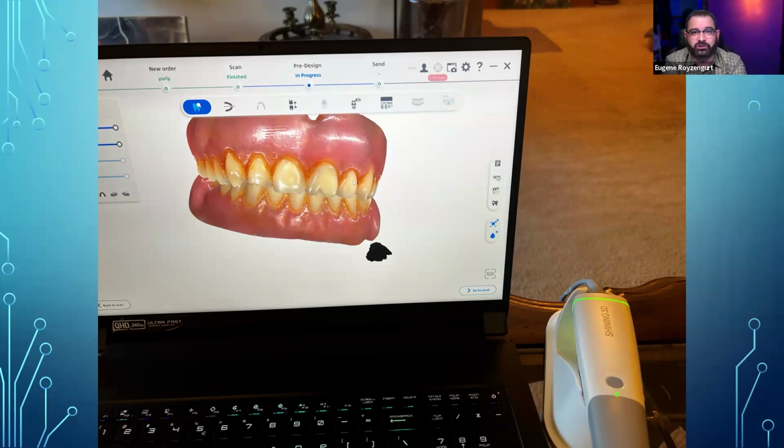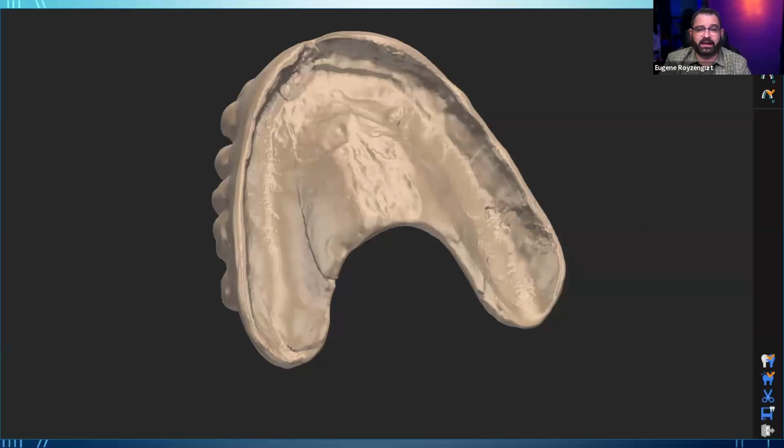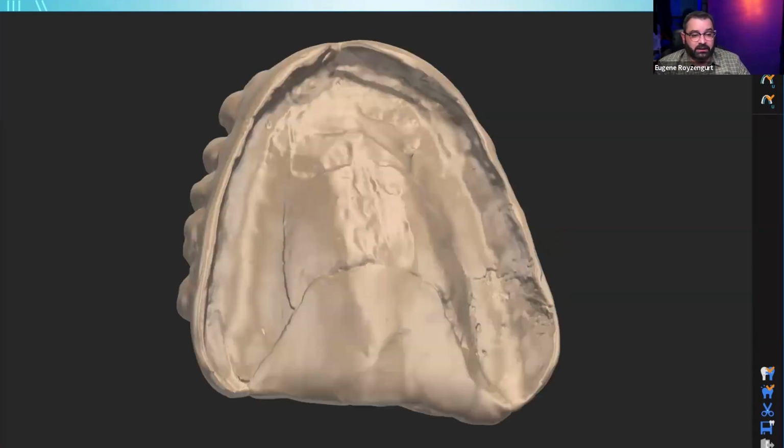And that allows you to do it in an easy way. Now, let's say, for example, you got a case where the patient did one of these Dremel adjustments, is what I call them, where there may be a gagger, or maybe they were not feeling really comfortable with the denture, and they took a Dremel and they cut a bunch of it out. Well, what you can do is you can digitally modify it, or you can just add a little putty in that area and scan that in, and then you can create a replica using that.